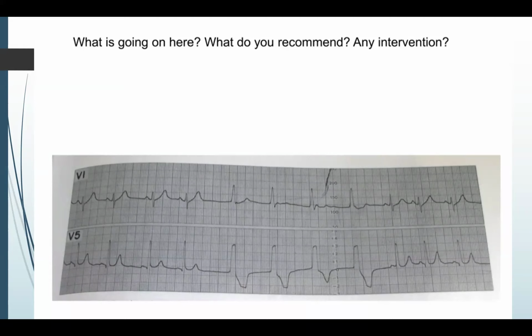So you called it VT. I would not call this VT. What would you call this? EP is a lot about nomenclature. Is it idioventricular rhythm? Yeah, you could call it that. I think normally we would just call this a ventricular escape rhythm.